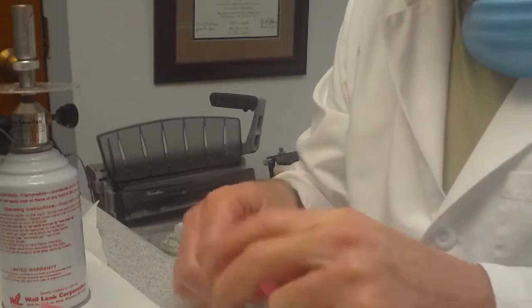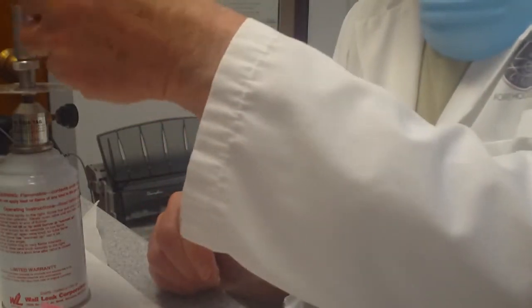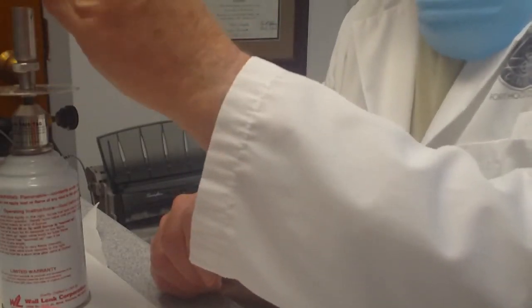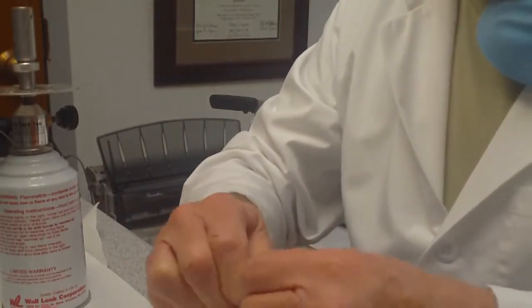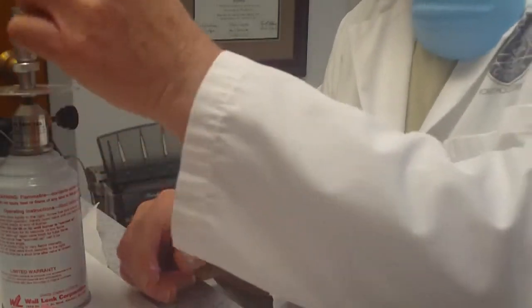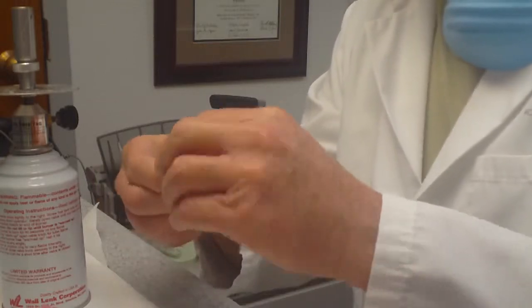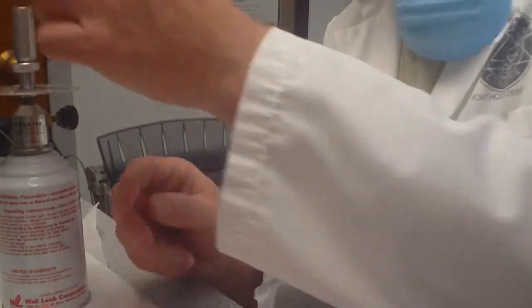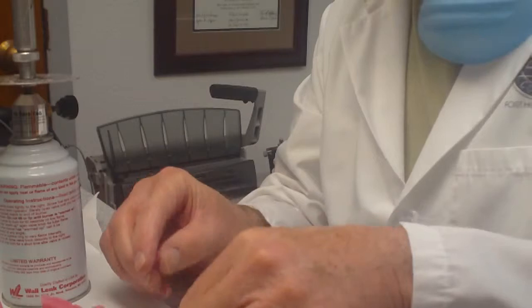And again, I just take some base plate wax. Obviously there's all types of base plate waxes, so select the one you like the best. All I'm doing is just warming up a piece, and you can see I'm going to start to create a little peculiar looking wax root, but I think you'll get the idea once I get it stuck on there, what I'm doing with it.